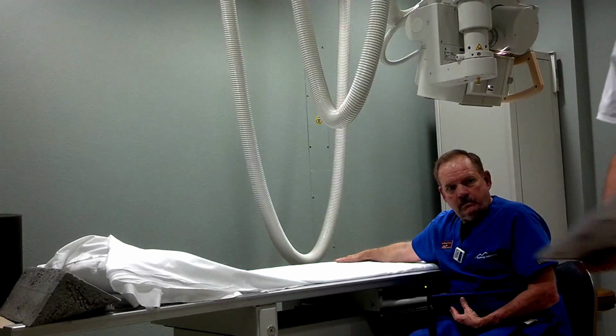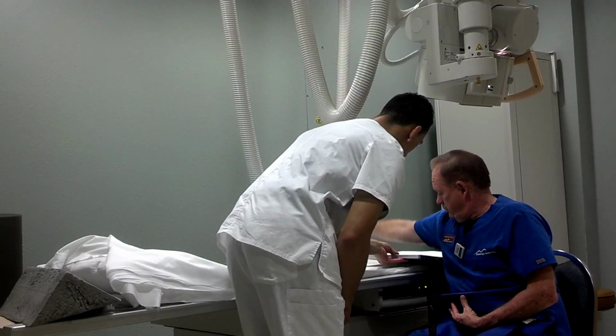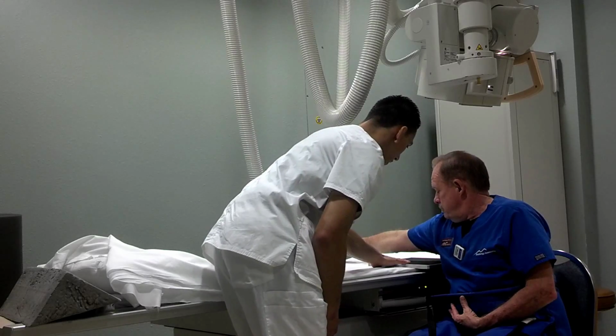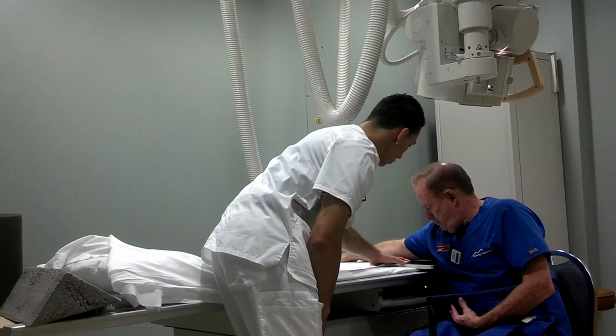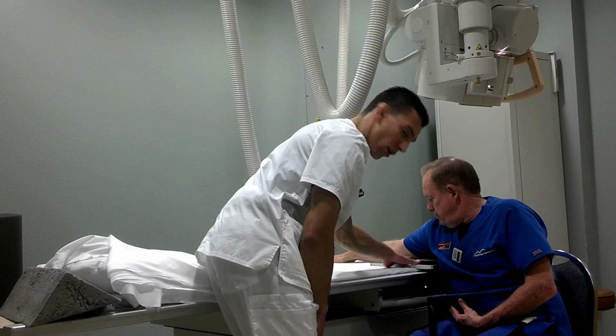So we grab our IR, and I want to make sure that it's centered right below his shoulder joint and really tucked in there towards his body to make sure that the shoulder joint is as close to the center of the IR as possible.